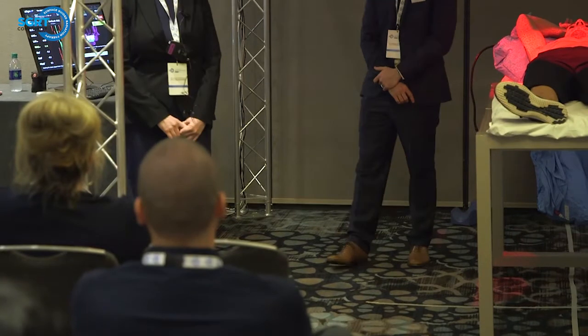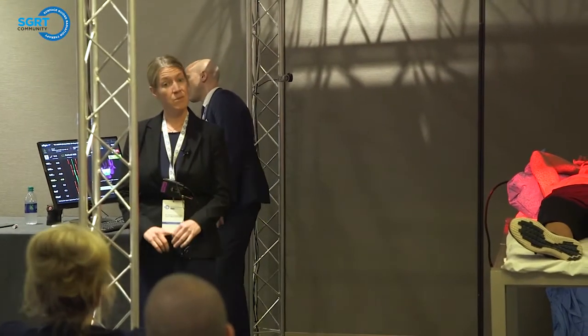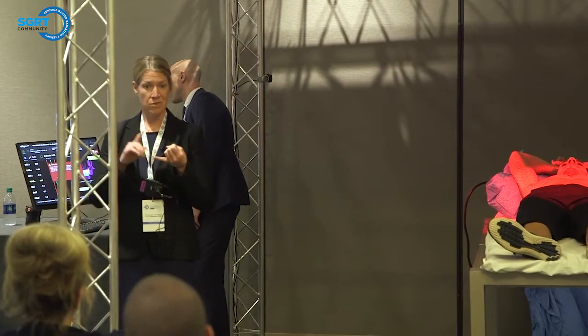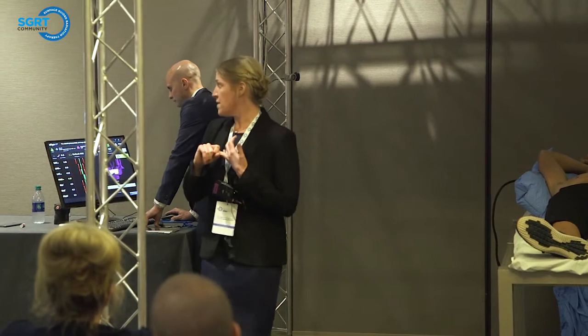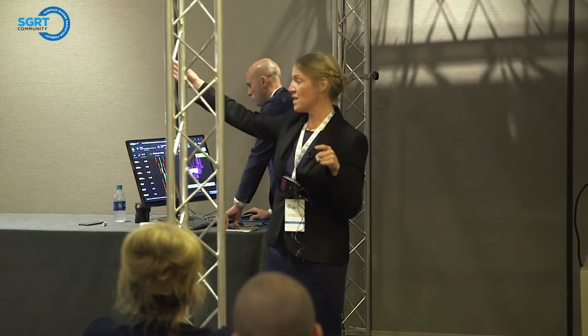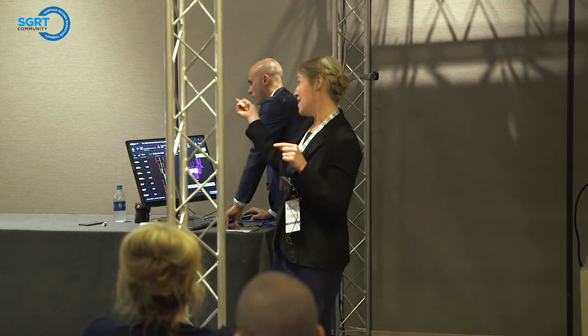Yeah, that's a great question. So the gated capture you'd want to use if your ROI was anywhere where there's breathing. So lung, abdomen, you would want to use your gated capture. The difference is if I just took a normal reference, I could capture that reference maybe at that patient's max inhale or max exhale. And if you do that and start monitoring, you'll see the deltas only moving on one side of the zero. So if I want to have an average of the patient breathing, I would do the gated capture.